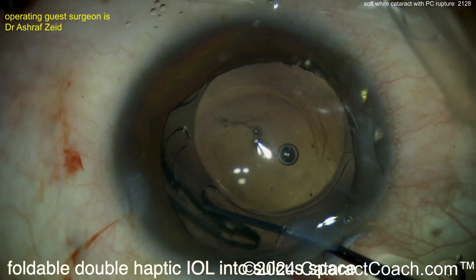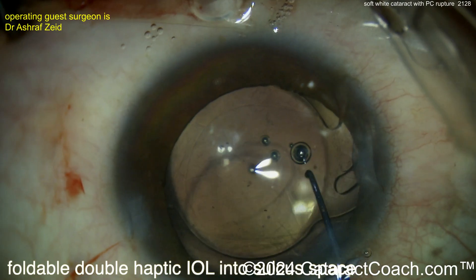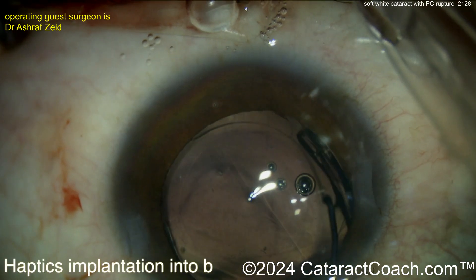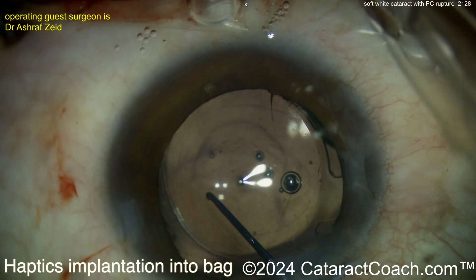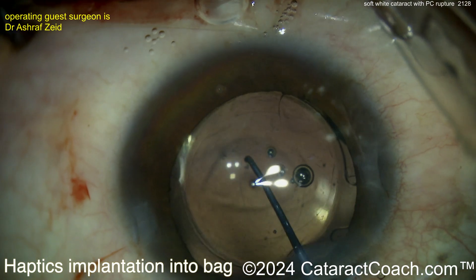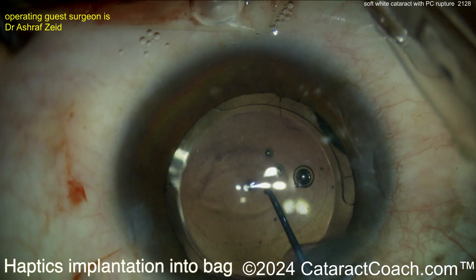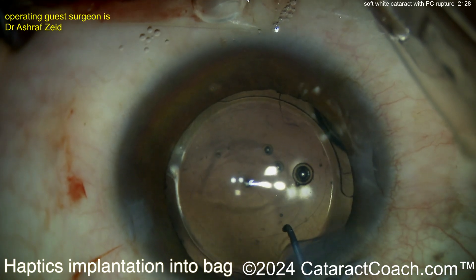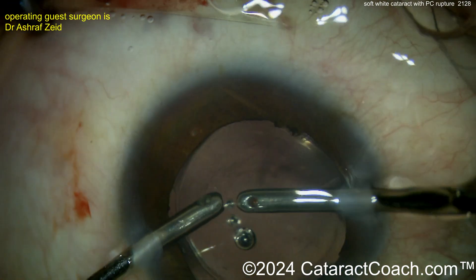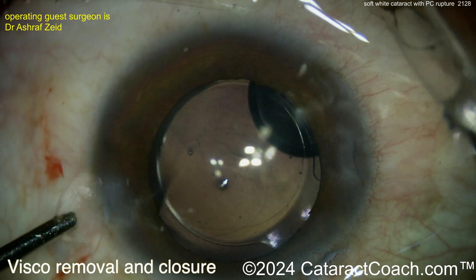If you do have an intact posterior capsular rhexis, you can put the lens completely within the capsular bag, because a complete posterior curvilinear capsulorrhexis is not likely to extend further. So now getting the haptics inside the bag — you now have an anterior capsular opening and a posterior capsular opening. A reasonable outcome. May want to put in some triamcinolone to ensure no vitreous is around, then clean up, remove the viscoelastic, seal the incision, and call it a day. Check out the cataractcoach.com website.